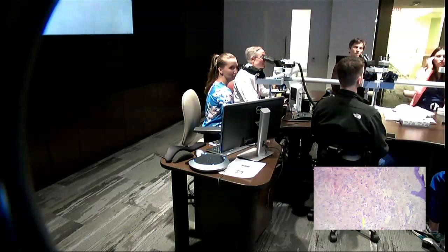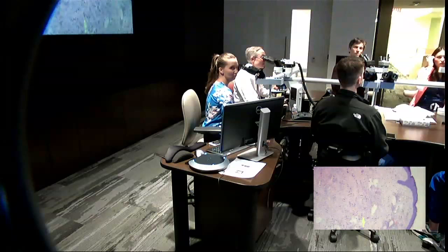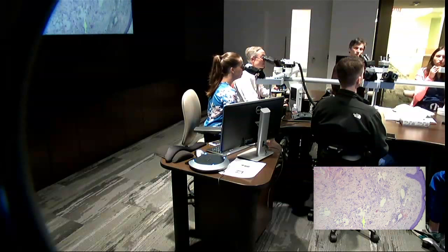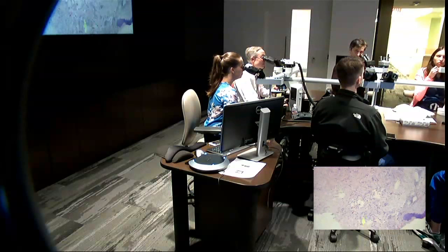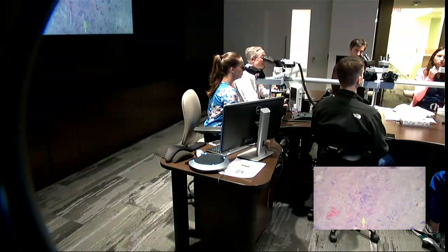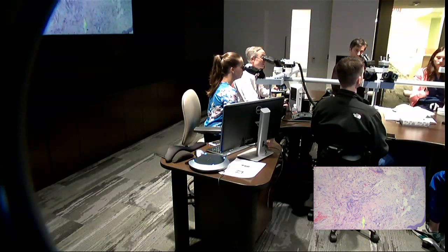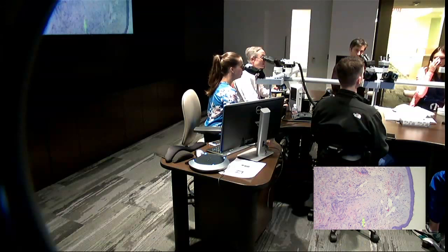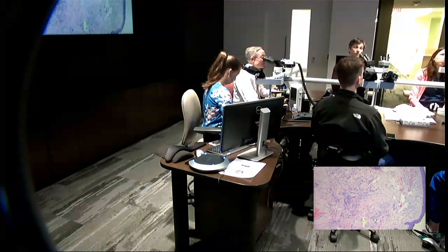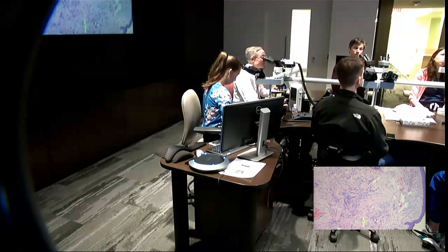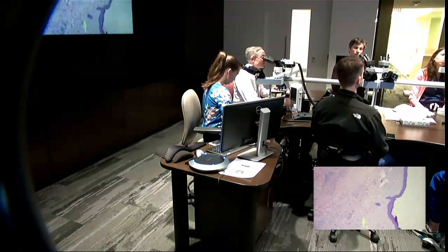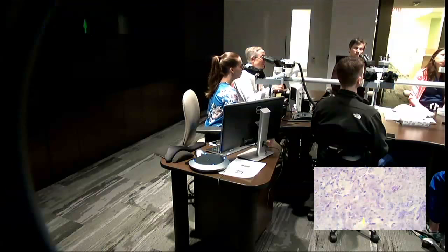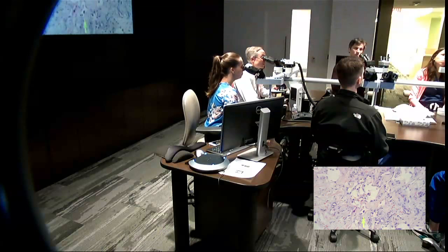I thought that it was sun-damaged skin. I didn't see hair follicles in here — you're right, there aren't any. So I couldn't really place body location. From there I just went Kaposi's sarcoma versus angiosarcoma. How do you tell those two apart?